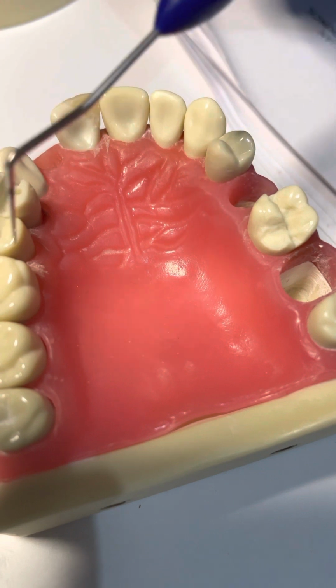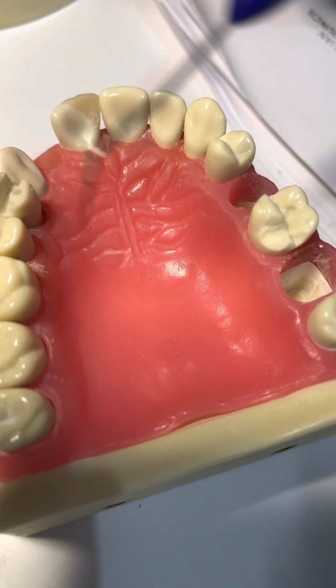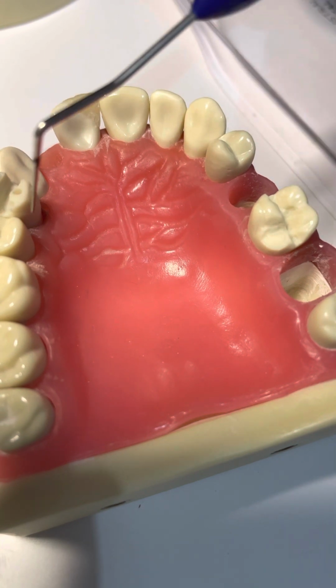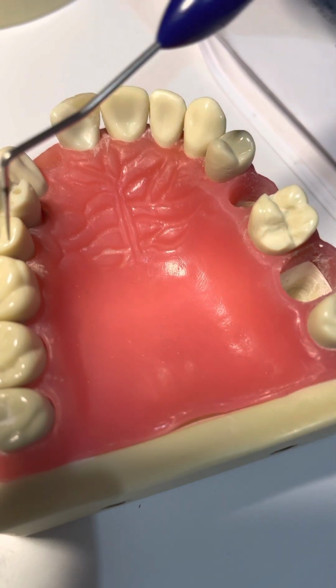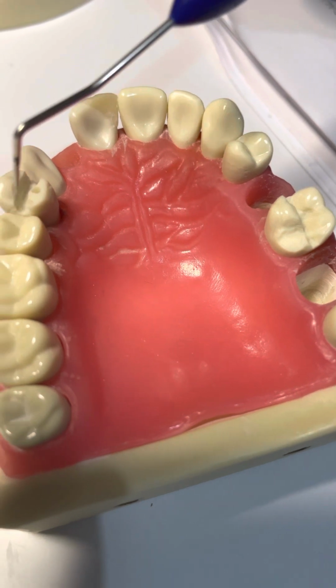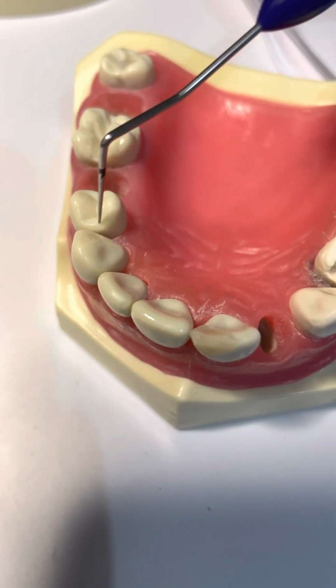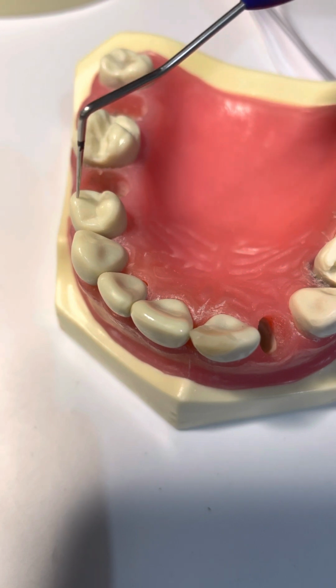Okay, so this is our anatomy and the marginal ridge. Then I'll talk about premolar. I'll finish the anatomy, then in a separate clip I'll explain the criteria. For premolar, we get a quarter MOD with the buccal cusp missing.